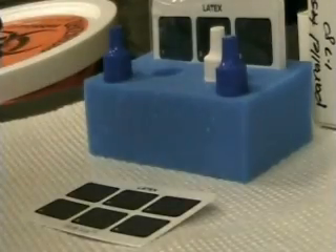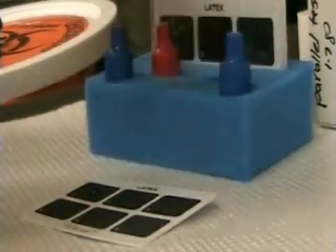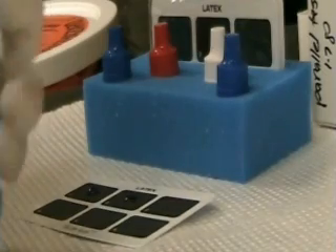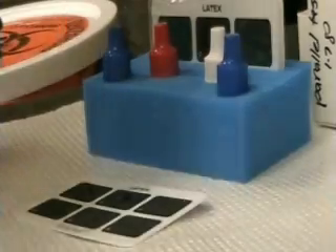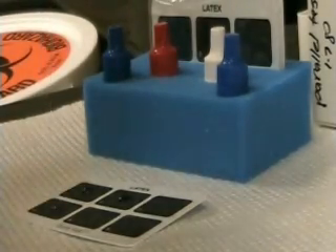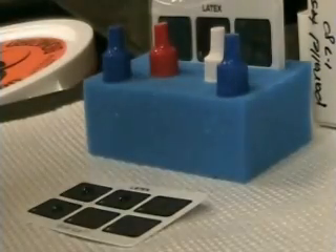Place one drop of your positive control and a drop of your negative control in separate reaction squares. Next, place your patient specimens in a separate square. Each specimen will need to be spread out into the size of about a nickel to allow for the agglutination to take place. You can use a pipette or a wooden stir stick to spread your specimens out. Remember to use a clean one for each specimen so no contamination occurs.